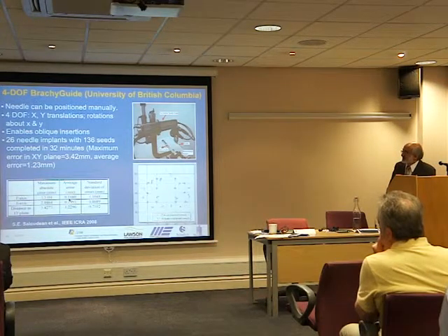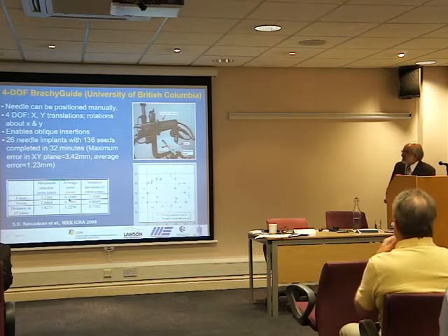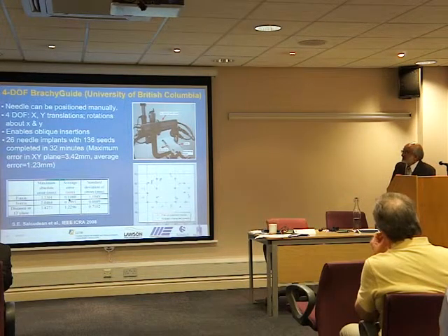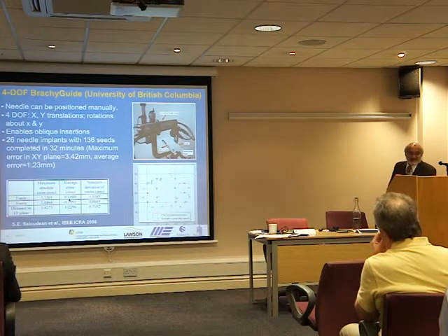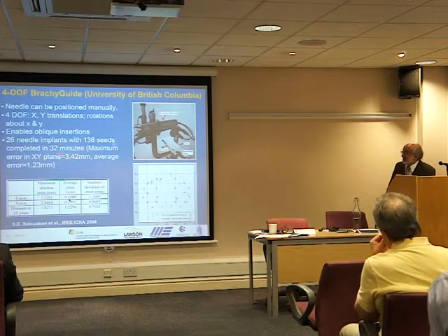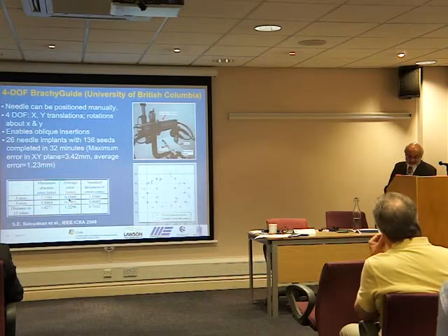There's some work done at the University of British Columbia. I think Sarkunin and his group have developed a system where the insertion is manual, but the accuracy is not very high. But they have actually done a number of evaluations, and they've shown that this actually speeds up the procedure of brachytherapy very much. It's very easy to use.